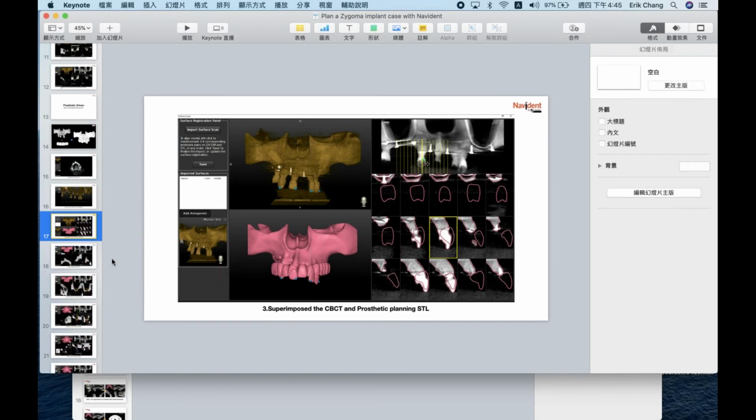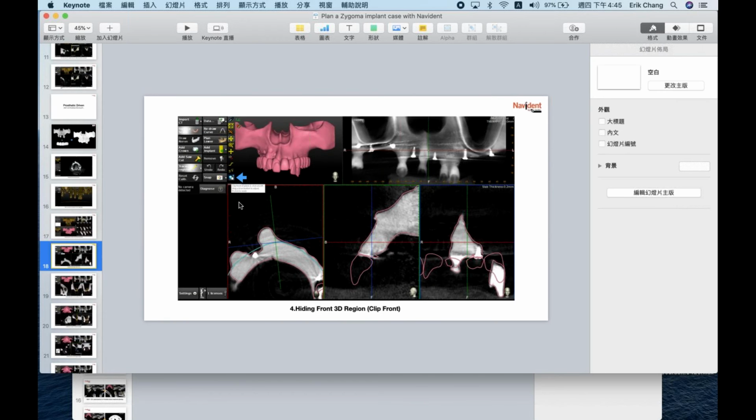And I will say we almost don't have to use the match mixer, because the technician has more powerful software like 3Shape or even exocad or Blue Sky Bio. So the match mixer is just from our side to help a doctor who wants something easier to use. But I will say always ask the doctor to ask their technician.